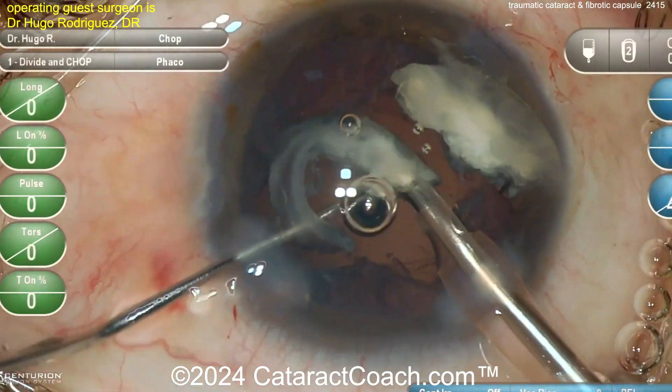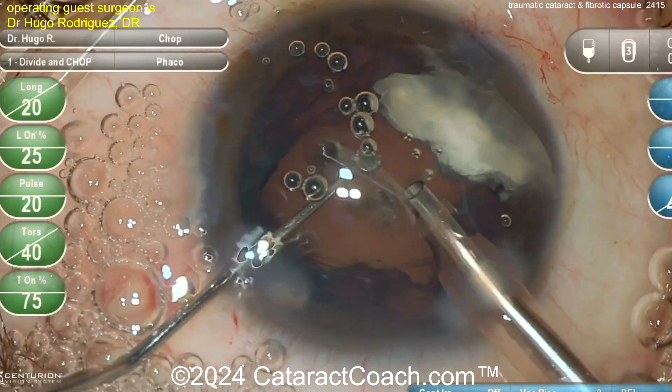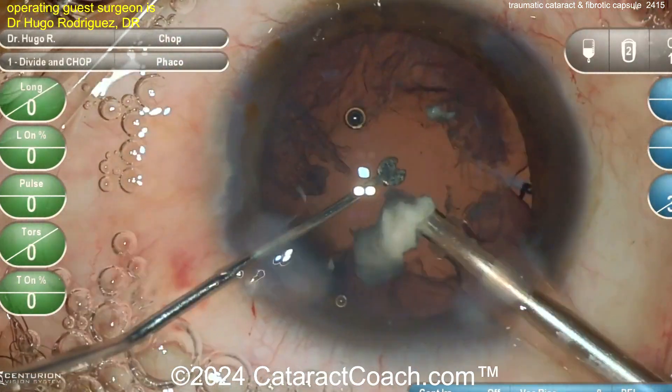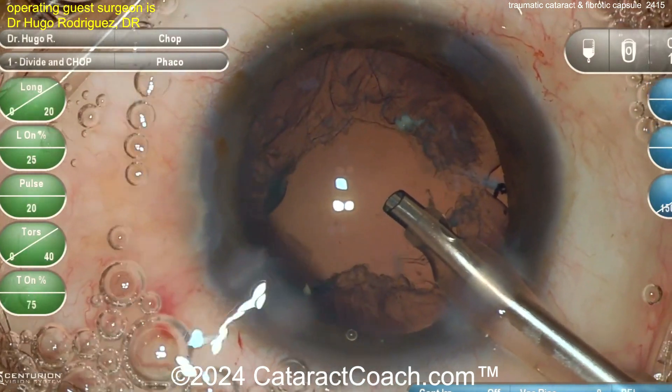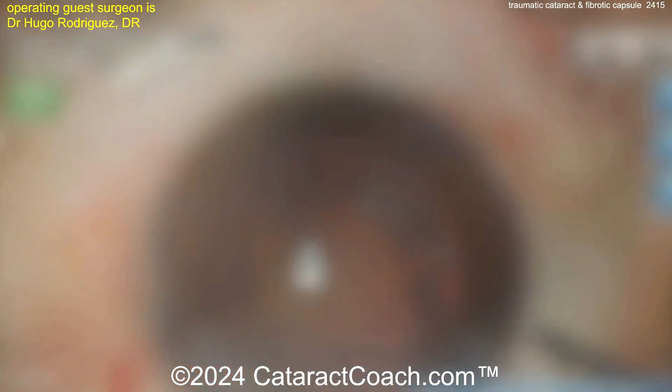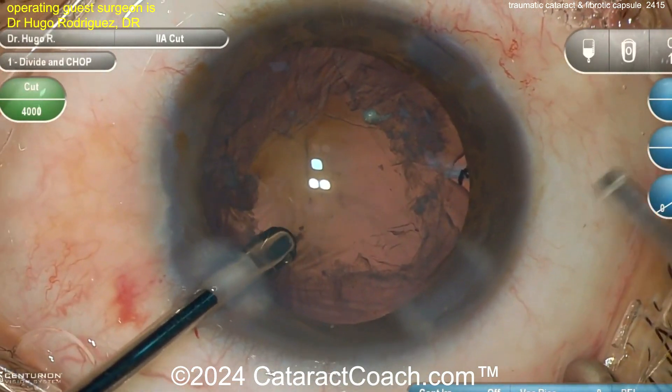Now go to the phaco probe. The phaco probe is going to be a lot easier — shoving this kind of lens material down with a 23-gauge vitrector is just not easy. Look at that: with a phaco probe you make short work of it, very very easy, much more efficient. And there is a good — looks like a good posterior capsule.